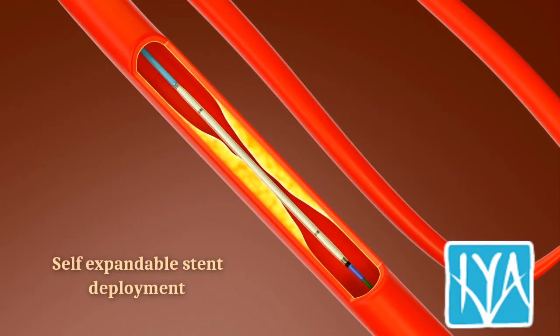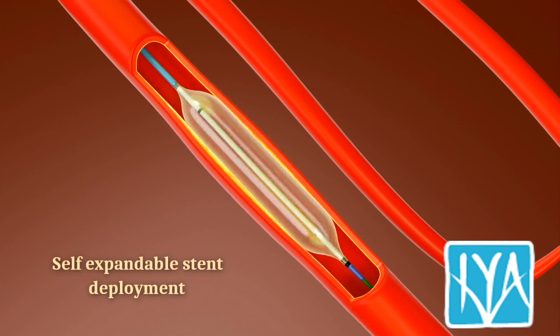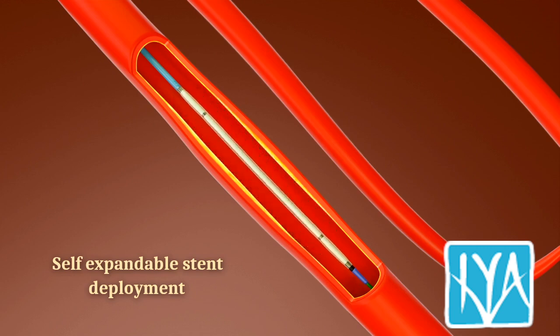Self-expandable stenting. Alternatively, the diseased segment may be treated with balloon angioplasty, followed by the deployment of a self-expandable conventional or drug-eluting stent for better flexibility.